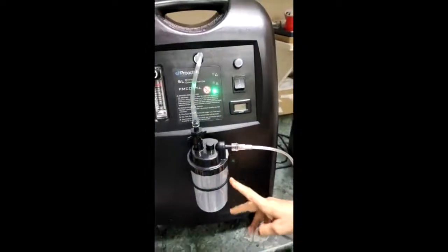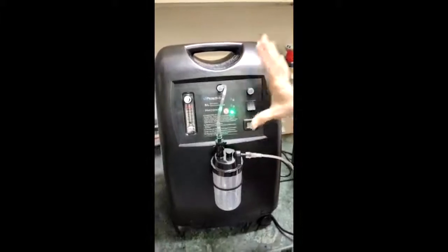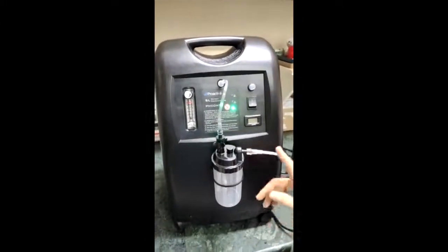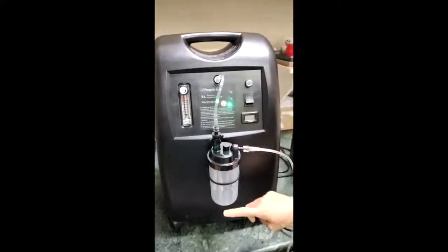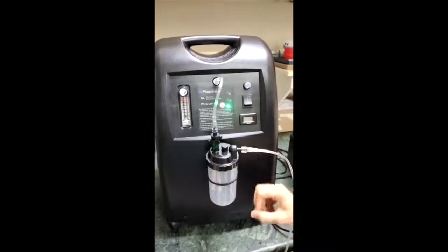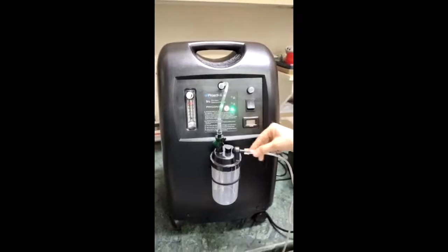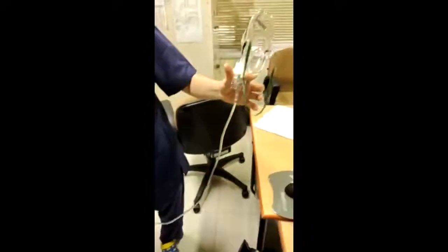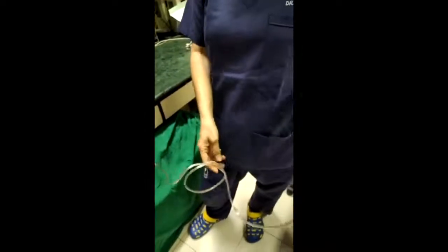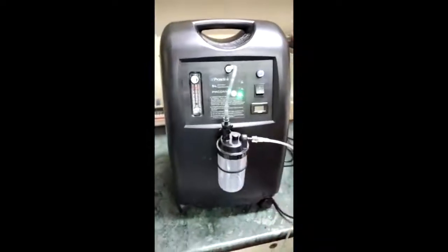You are supposed to fill water in this bottle. However, the oxygen coming out is at room temperature, and the water you fill will also be at room temperature. No matter how much oxygen bubbles through it, the pickup of moisture or water vapor will be negligible. Furthermore, as that oxygen travels through the long tubing exposed to room temperature, even the negligible water vapor picked up will precipitate out. So ultimately, the result of bubbling oxygen through this water is zero.